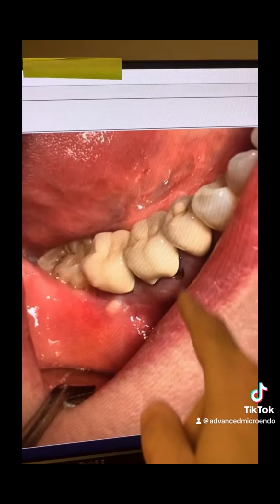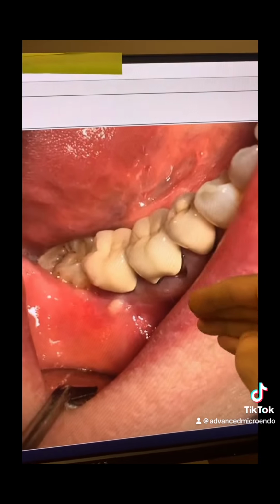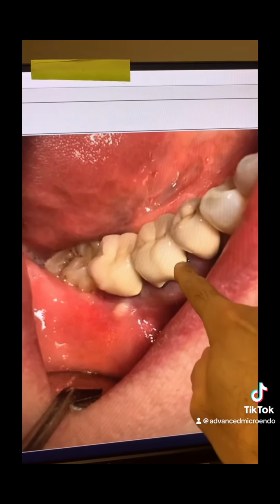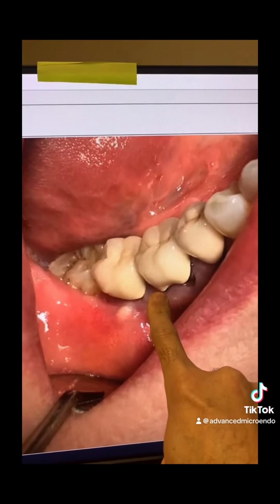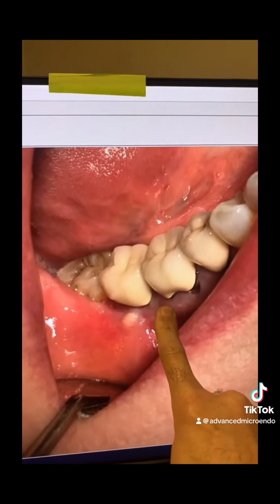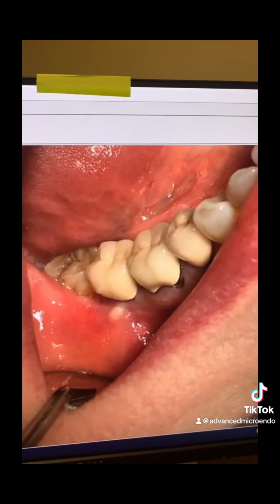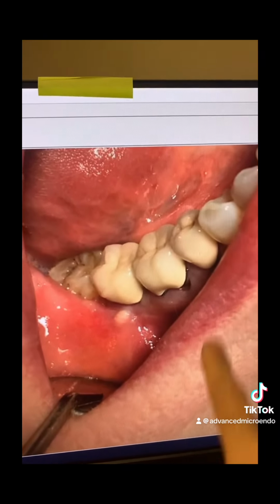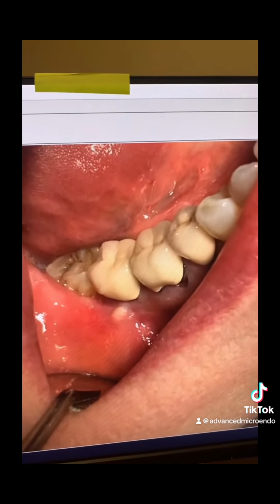What will that mean when you want to redo this root canal? That means that this wall, the buccal wall associated with the mesiobuccal canal and distal buccal canal, that buccal wall is very, very thin. Very thin now on the coronal part of the canal.